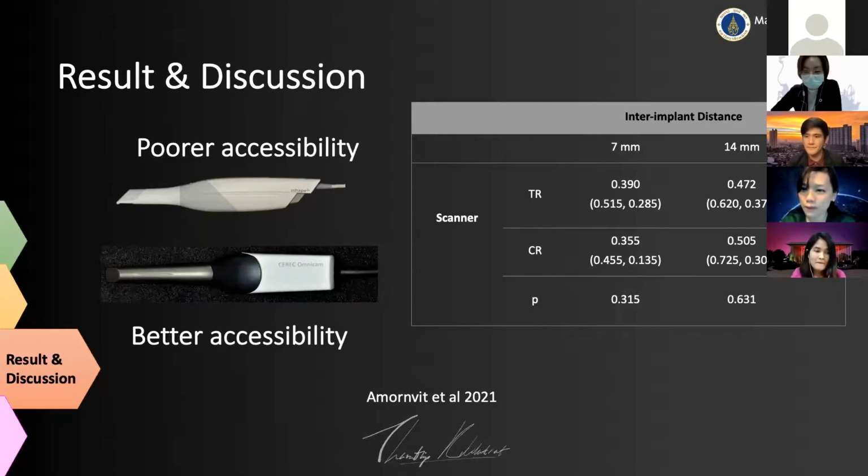From your experience, can you tell us about the advantages of the conventional way? I mean, what are the pros and cons between these two techniques? For example, the money you have to invest in intraoral scanners. And when we scan with an intraoral scanner, can we use the information directly with the lab, or do you have to put it in another machine before transferring it to the lab?